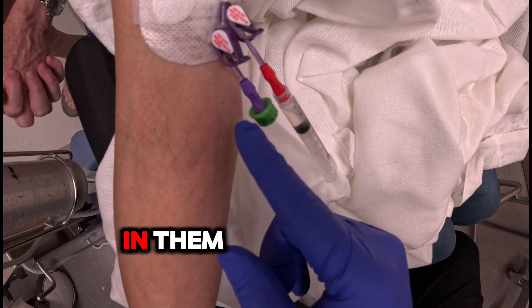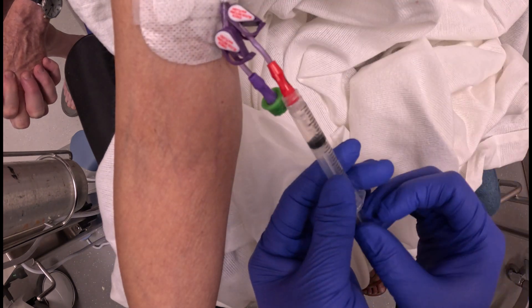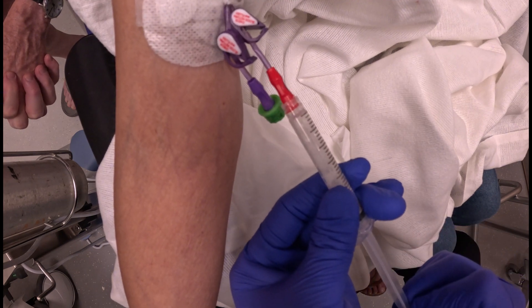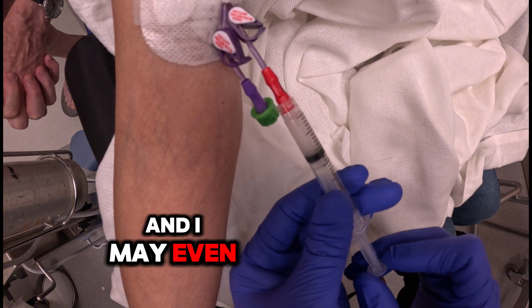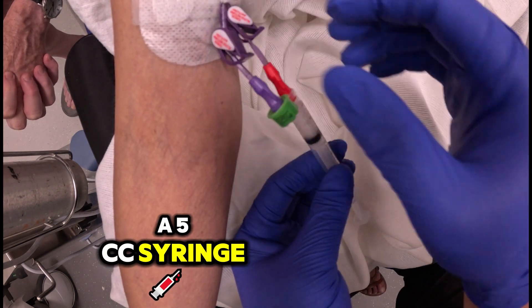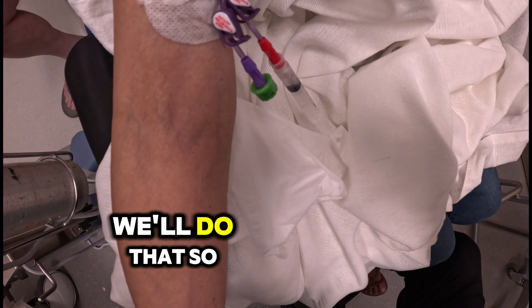Either they're going to go home with this sitting in them, or we're going to make it patent and then aspirate the blood out. I may even switch this out for a 5 cc syringe so I have more negative pressure to agitate it even better. But for now we're going to leave it for another 15 minutes and we'll be back.